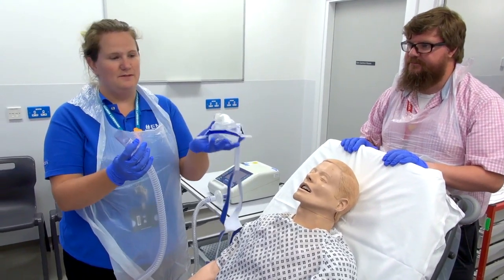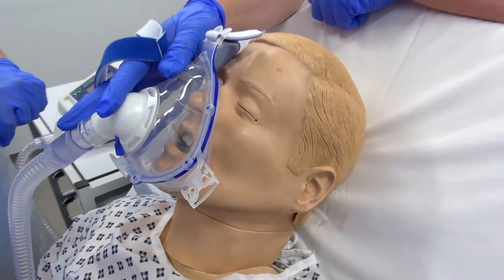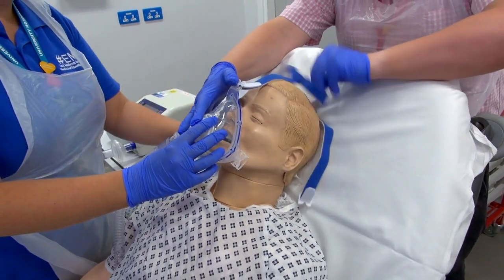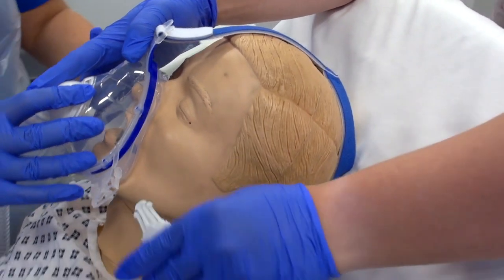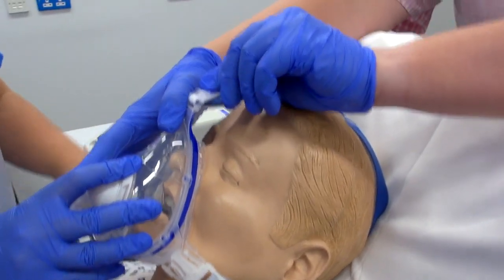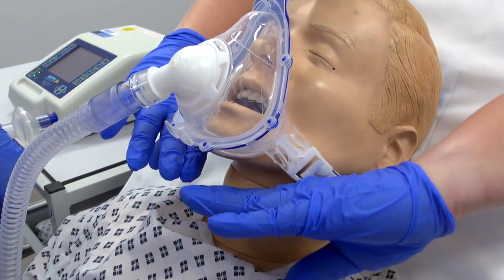First attach the tubing to the mask, then place the mask over the patient's face. In a cooperative patient you can get them to hold the mask so they get used to the experience of non-invasive ventilation. The straps go at the back of the patient's head — it's a two-person job to allow you to hold the mask and attach the straps, one strap on either side. Pull on the tabs to tighten, then do the same on the top aspect. Once the mask is attached, feel around it for any leaks — you shouldn't feel any air coming onto your hand.